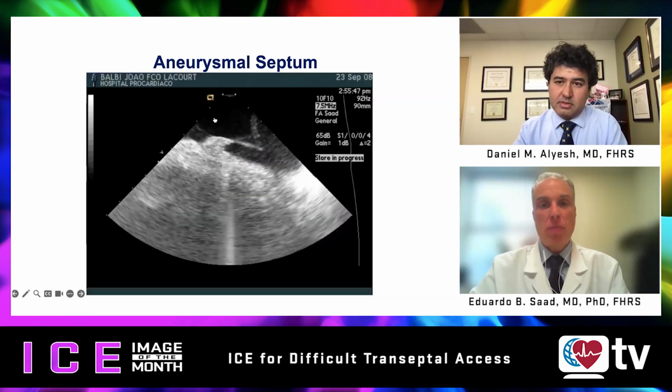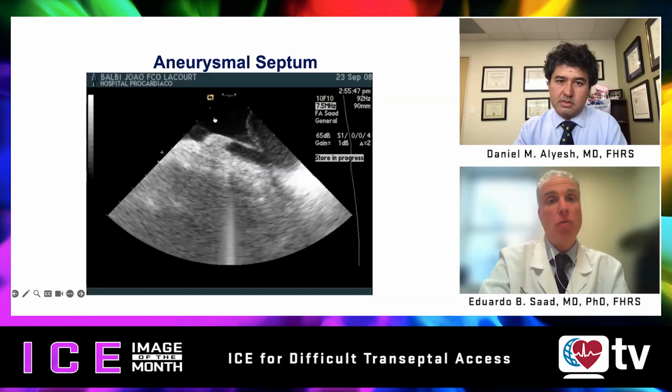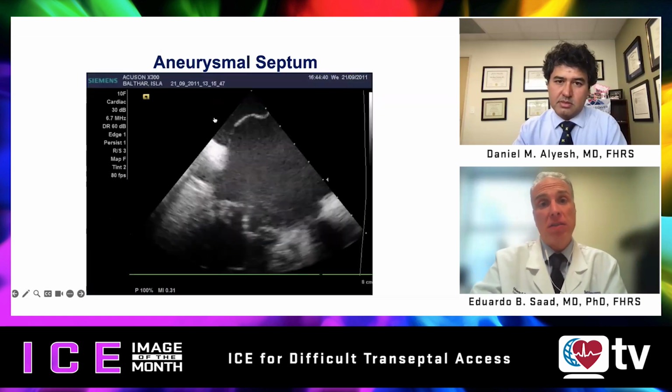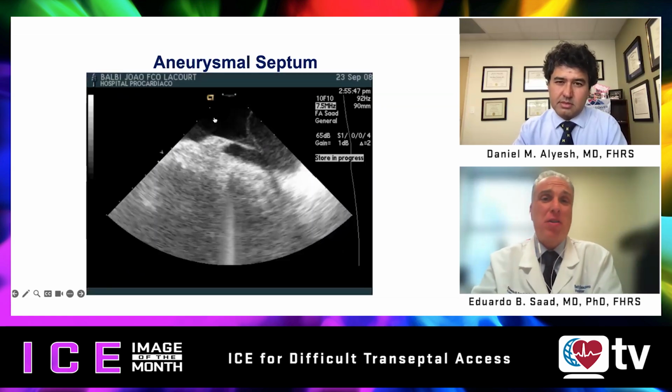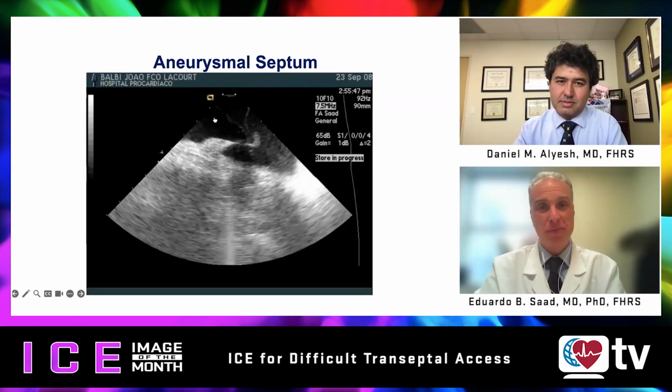Absolutely agree. The traditional approach here is somewhat dangerous because you don't have that much control of how much pressure you need to go across. It's about the same amount of pressure that you need to actually provoke a perforation in the posterior wall.